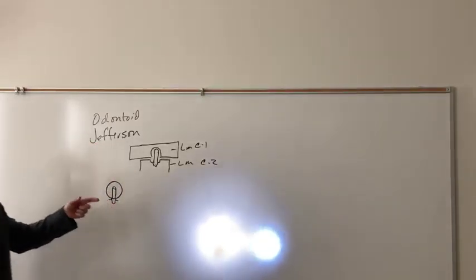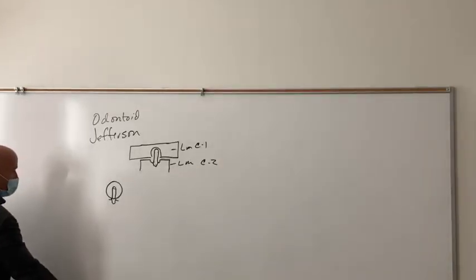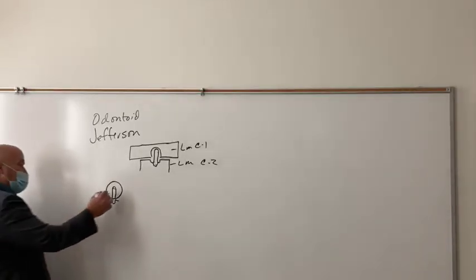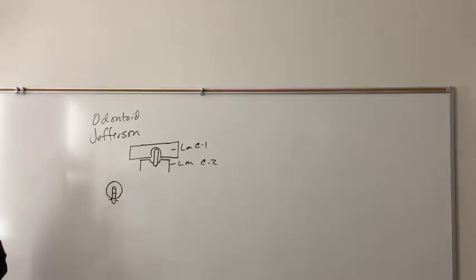Number one, most of your fractures that you're interested in seeing on an odontoid process, you inherently cannot see on a Fuchs because they're going to be too low on the odontoid process. In the event that we've got a fracture across the middle of the odontoid process and we've got an angulation on our central ray, you're not going to see it, okay?